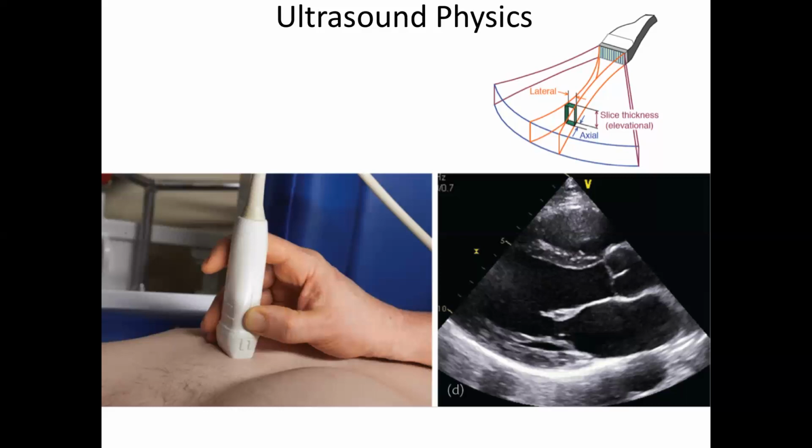For this, I think we saw it was about 3 millimeters, something like that. And that seems pretty reasonable, right? A 3 millimeter slice, and a lot of them are using 5 millimeter slices, something like that. Can you shrink that? Yes. Make it narrower? Absolutely, you can shrink that, and we'll see that. So the question is, can we, by doing some kind of shenanigans with the transducer, reduce the slice thickness so we get higher resolution in the slice direction? And the answer is yes.